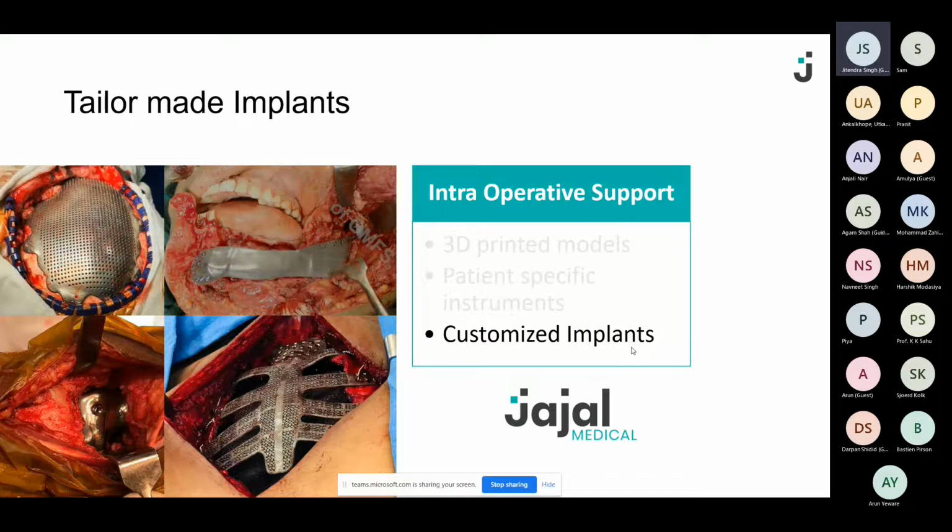And a lot of design control comes into the picture here, as I recall from Utkarsh's slide, whether it's an optimization of the topology, or the structure, or microstructure changes that you would wish to incorporate to have better osteointegration, or maybe better microvascularization.